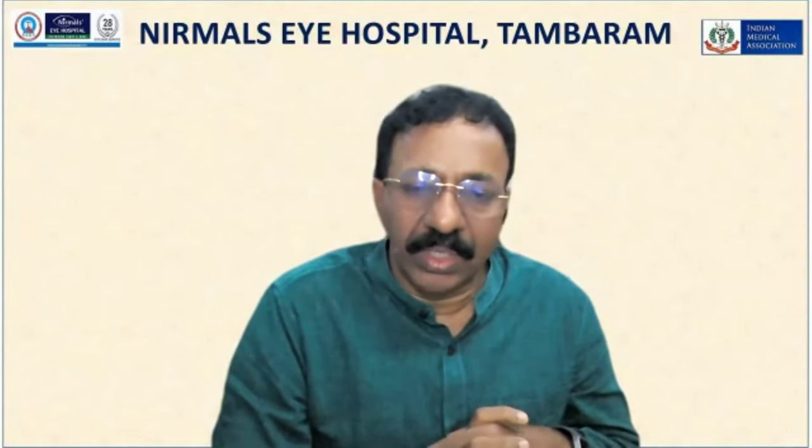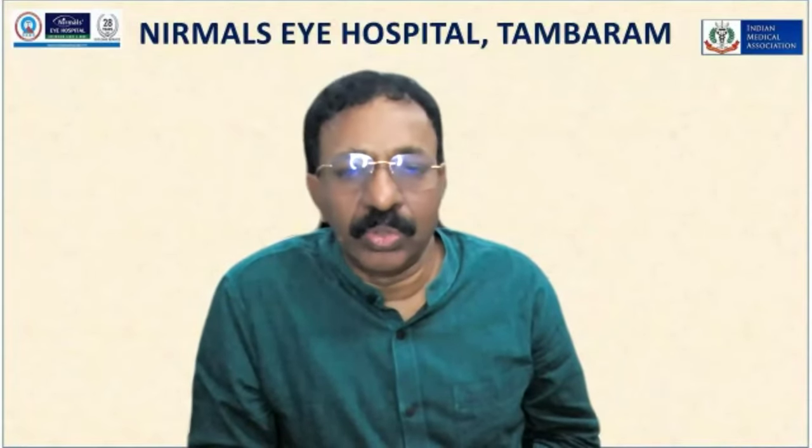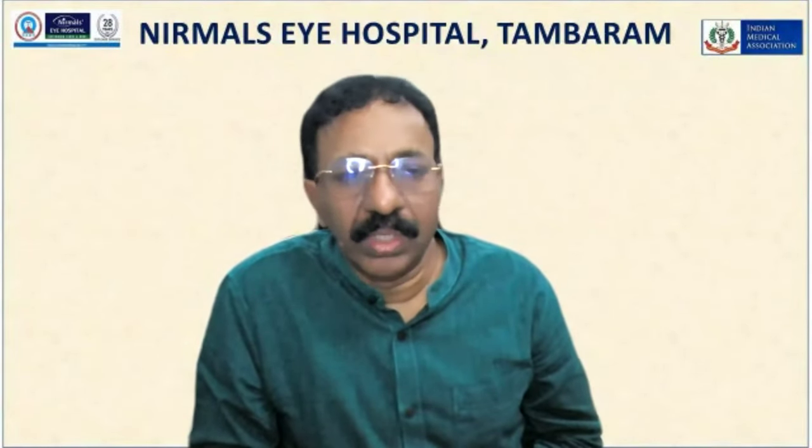So I would rather focus on three things first. One is the infrastructure, where you need to focus on equipment, and the methodology of the sterilization. I think Dr. Raju has given enough information about using a good autoclave, and in ophthalmology we are using a lot of hollow tubings, and we are going to reuse that equipment, so it is better to stick to class B.